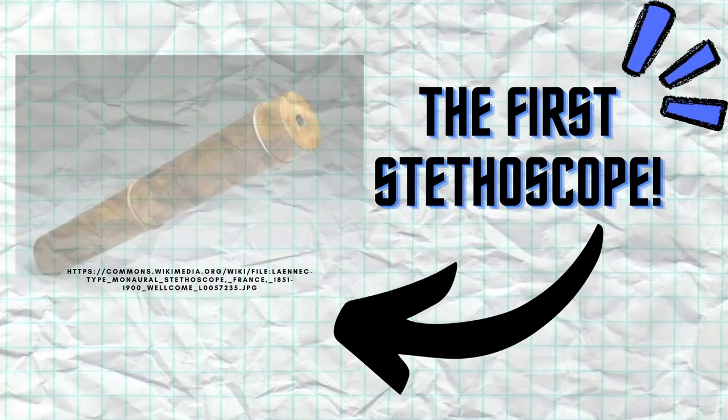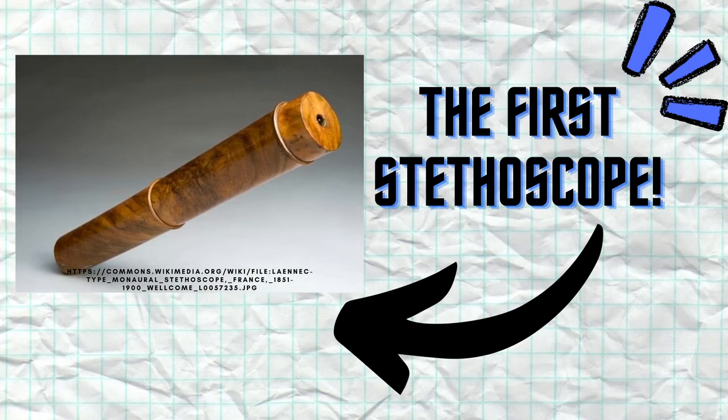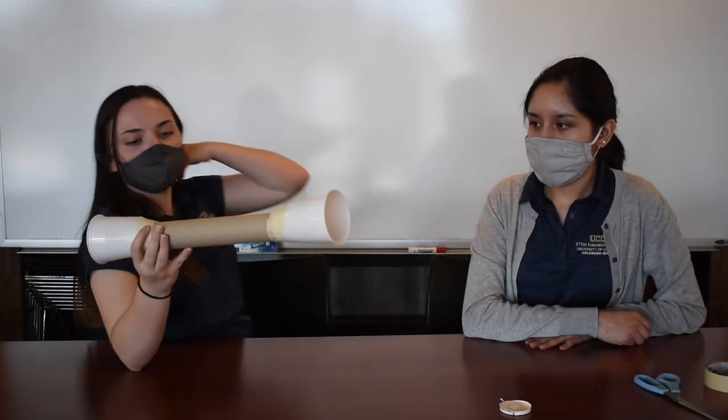An interesting history fact is that the first stethoscopes that were developed looked a lot like the ones we made today and helped doctors listen to their patient's heart. When you've decorated your stethoscope, you are now ready to use it.